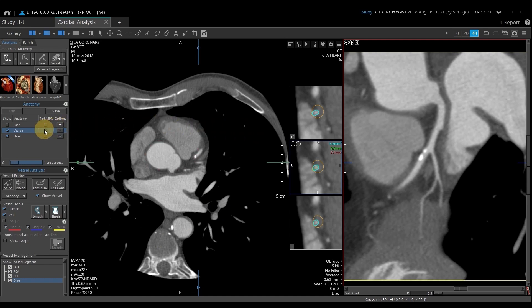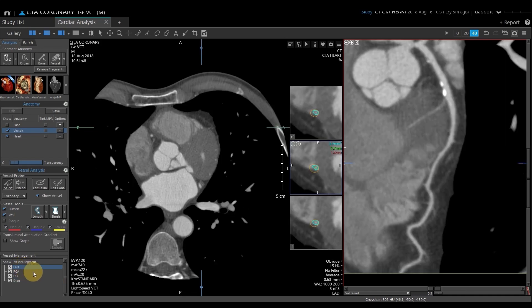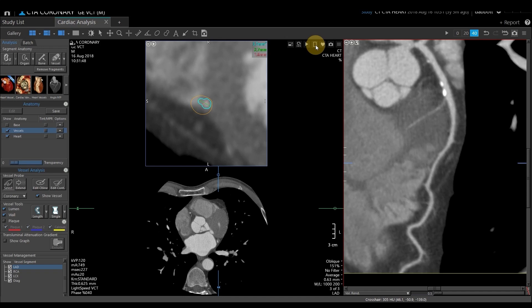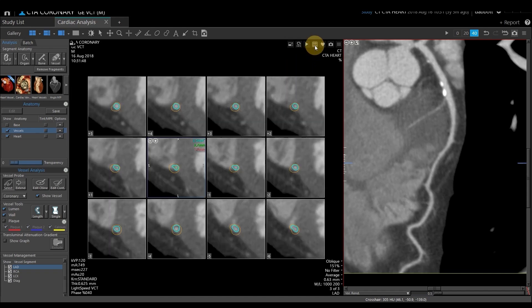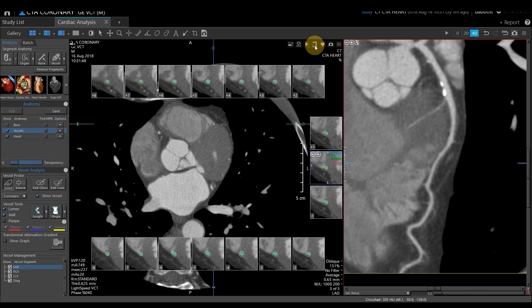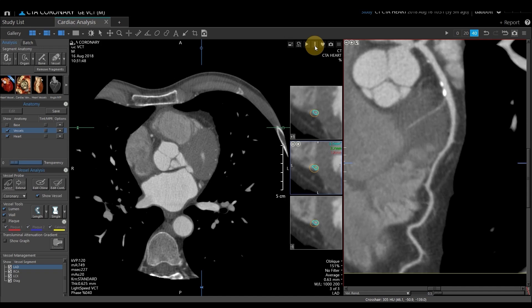I'm going to turn off the Vessel Tent and demonstrate some additional layouts available to you — I'll switch to the LAD. This is a three-box layout. You have different layouts at the very top of the screen: a large transaxial slice, a simulated cath-type view showing the LAD, and a matrix with transaxial slices. The last option is a reverse C, which gives you your center point and slices millimeters above and below. Toggle it one more time and we're back to the standard layout.